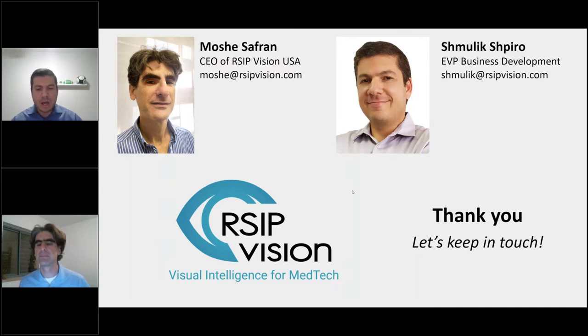Well, I have one asking, do you have other examples for clinical applications of measurements of 3D reconstruction? From Todd, I'm sorry, I forgot to say. Yeah, sure. So I showed a potential intraoperative application, right? Surgeons use surgical rulers as a measurement tool, and this is a very natural application of computer vision. If you track a couple of points and you have some sort of tool in the field that can be used as a virtual ruler, that opens a general-purpose intraoperative measurement application. Now, regarding other applications, the most natural one that comes to mind is preoperative measurements. For instance, in planning in orthopedic surgery, you need to decide how and where to position the implant, and you want to select the size of the implant. All this is based on landmarks that you detect in the pre-op imaging, and that's a very common task for surgical planning that involves precise measurements.